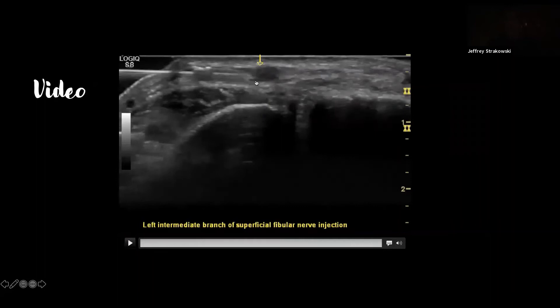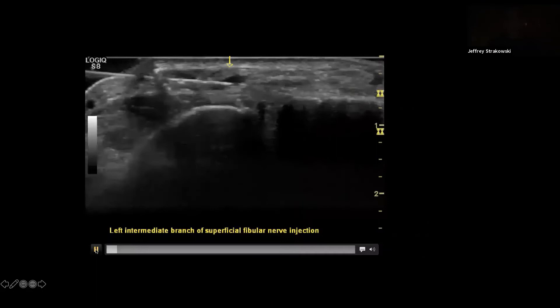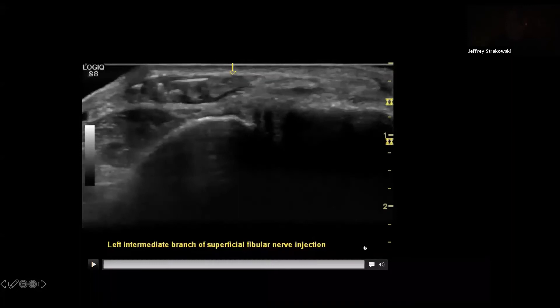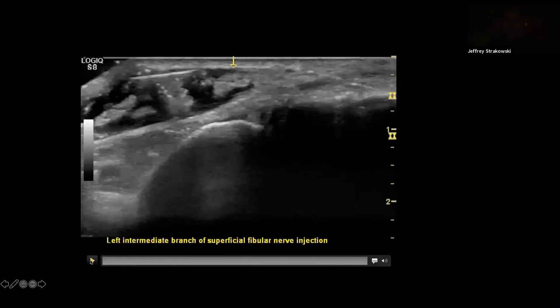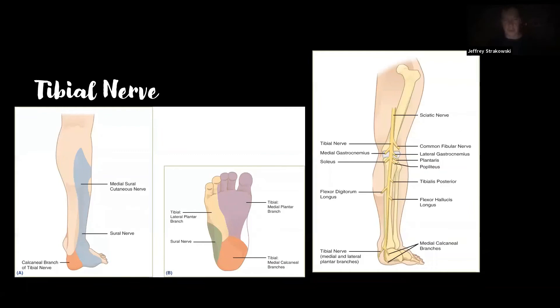For the hydro dissection technique: we always do in-plane with the needle, usually short axis but sometimes rotating to see in both views. When the nerve is very superficial and caught in scar, go past the nerve first and add a little injectate to add conspicuity to the borders of the nerve, then come backwards to make sure you're not causing nerve trauma. Then move out on both sides to open up space and alleviate the scar with hydro dissection. She was very happy after a couple of injections like that.